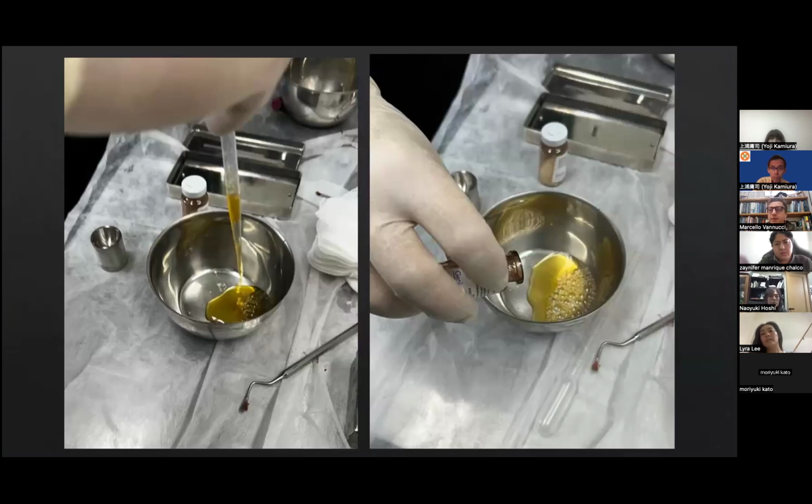And first, this is the IPRF. IPRF is a liquid, for injection when aggregated with biomaterial, the osseous substitute. When you use this, use the white tube, at 2,000 RPM for 4 minutes.